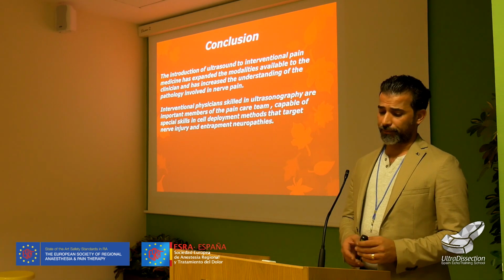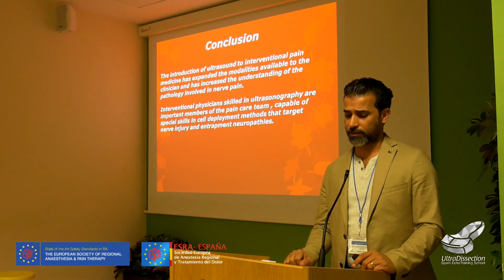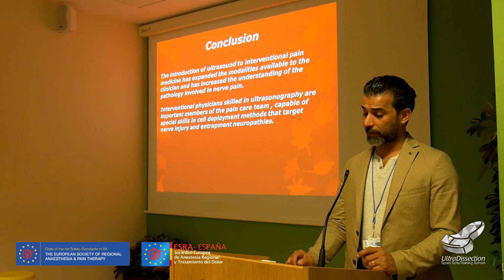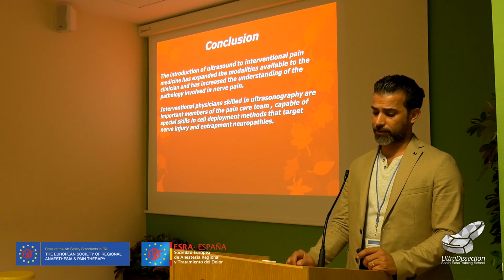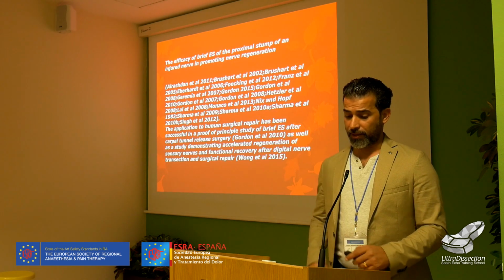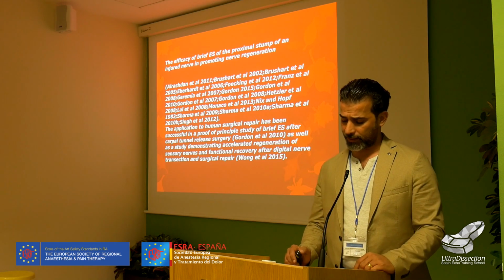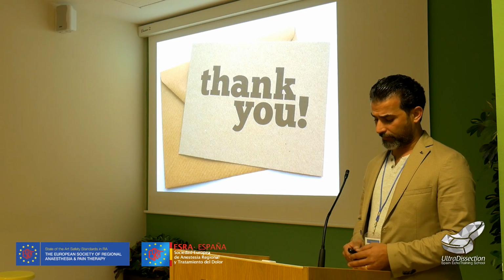So the conclusion: the introduction of ultrasound to interventional pain medicine has expanded the modalities available to the clinician and has increased the understanding of the pathology involved in nerve pain. Interventional physicians skilled in ultrasonography are an important member of the pain care team, with special skills to target nerve injury and entrapment neuropathies. And electrical stimulation of the proximal stump of an injured nerve promotes nerve regeneration. These are the studies and the groups who did them. Thank you.